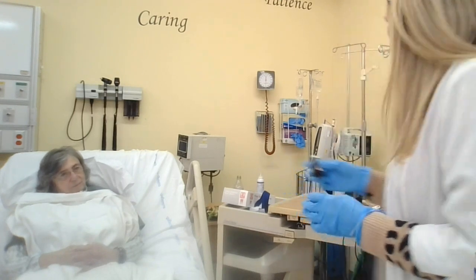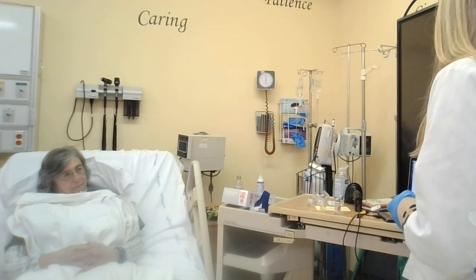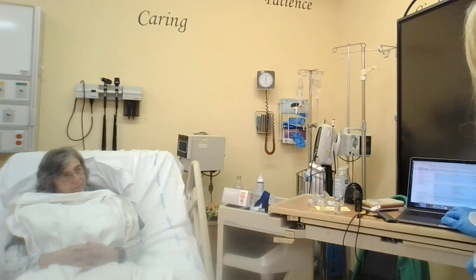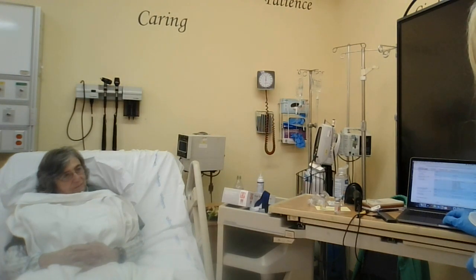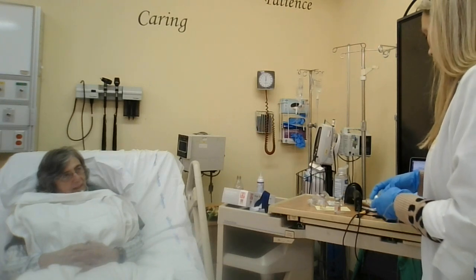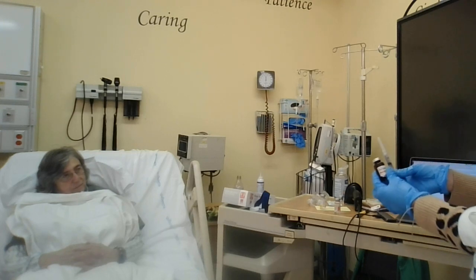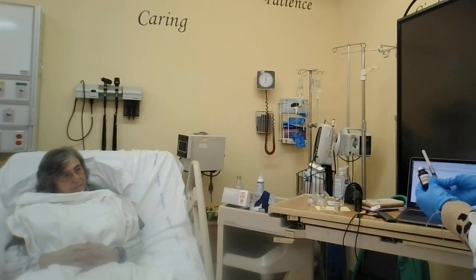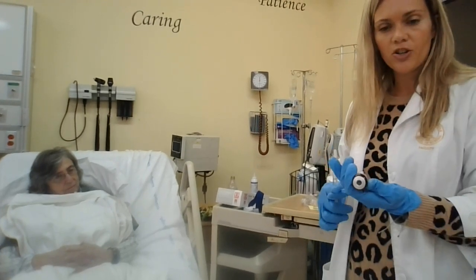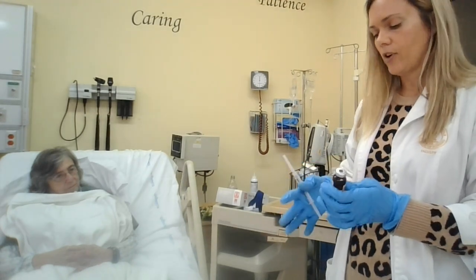All right, so I've got my Lasix. I'm going to click on that, then I'm going to administer it. If I can find it on here. Okay, there it is. Okay, so I've got for Chris Jones, furosemide, 20 milligrams or 2 mLs. I'm giving it IV push today at noon for elevated blood pressure. The critical assessments we've already completed, blood pressure, BUN and creatinine, and potassium, all are within normal limits and it's safe for us to give.